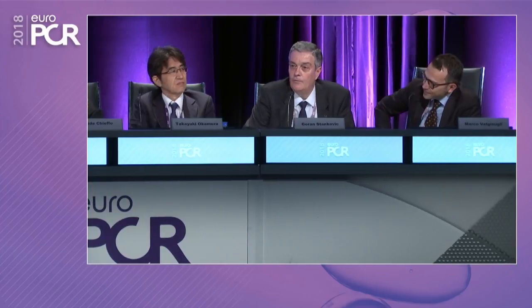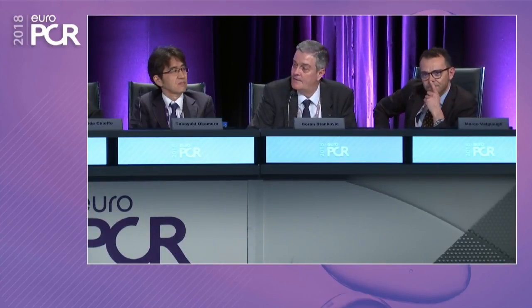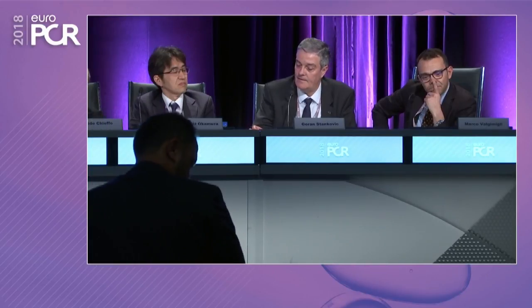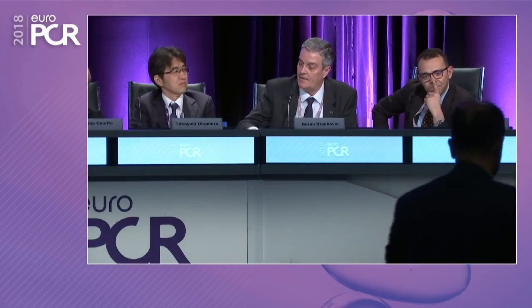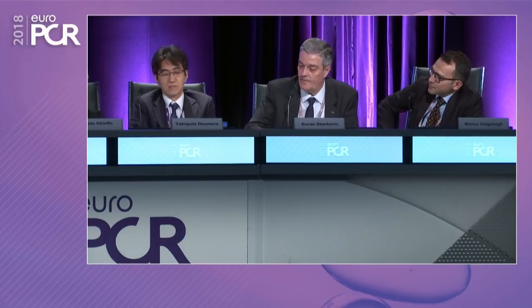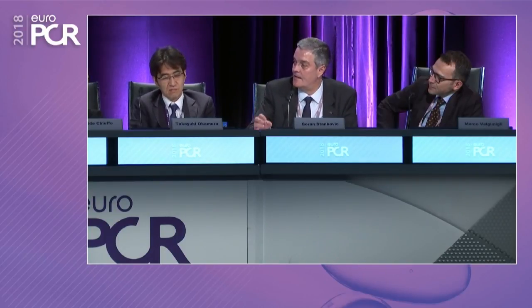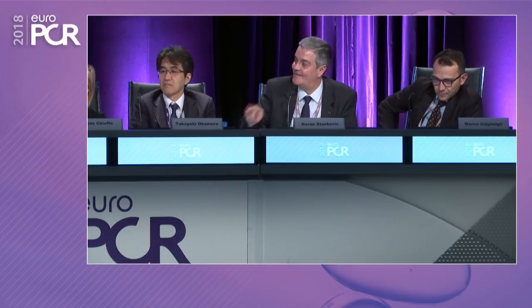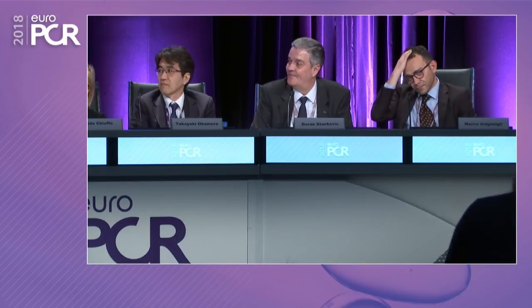Yeah, I will do it, based on the Japanese J-REVERSE study, because they evaluated by OCT the result after kissing. And if you have an oval shape deformation, at the follow-up you have more neointimal proliferation. So oval shape creates unfavorable hemodynamics, and that's the reason why a more circular one, a good rounded balloon, will make a more physiological lumen.